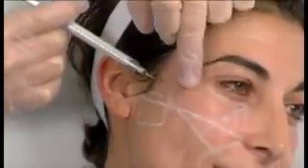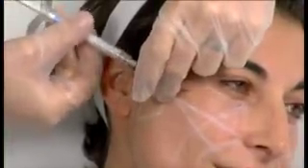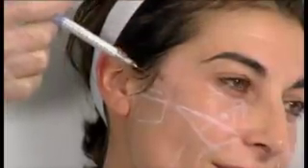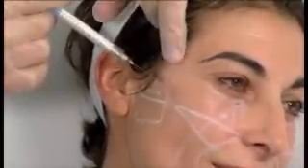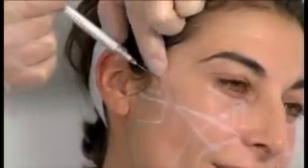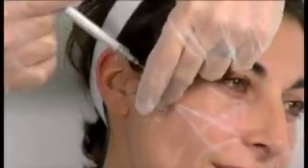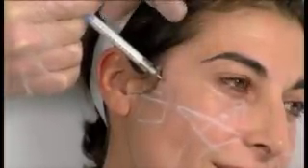You can see it's quite high up. So I'm a little bit too high. I go back and I have to find another way. You see, with the cannula, it can be much more of a challenge to get to the right position that you want, because the cannula will take the path of the least resistance. Now, when I just came back, I did a retrograde deposition of Radiesse, and I injected 0.1 milliliters of Radiesse. I'm going back, and I'm following the periosteum, and I'm right here with my tip of my cannula.